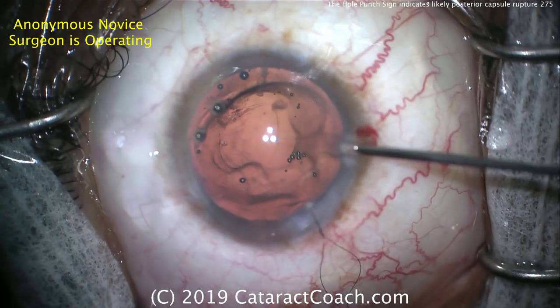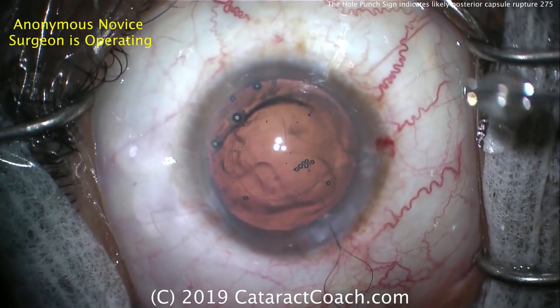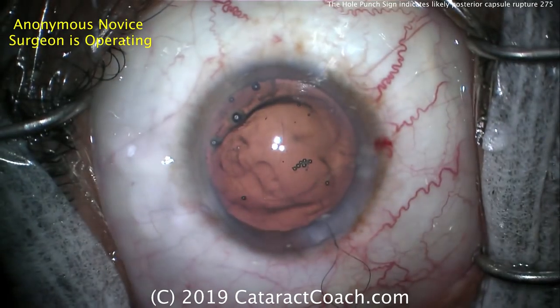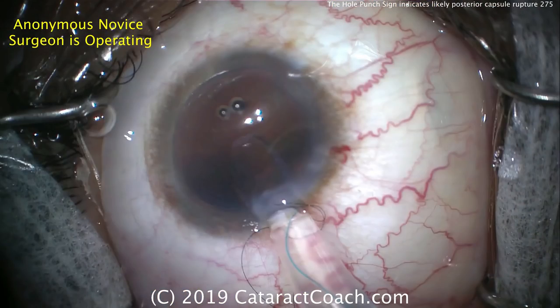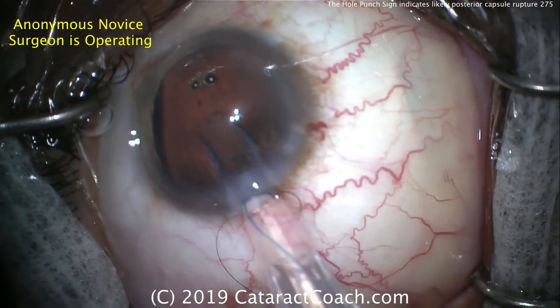We have to watch these patients very carefully. More viscoelastic is going into the eye to create a tamponade — I like that, that's a good move. Let's fast forward. Here's now the insertion of the lens — a three-piece lens can be placed in the sulcus.